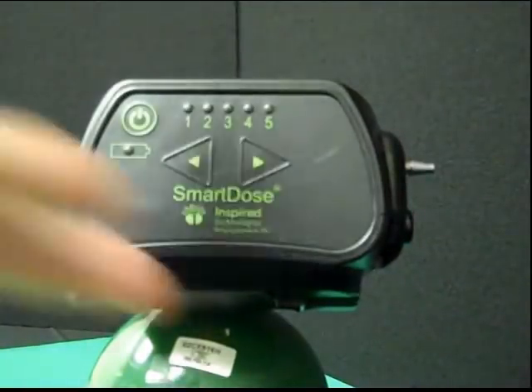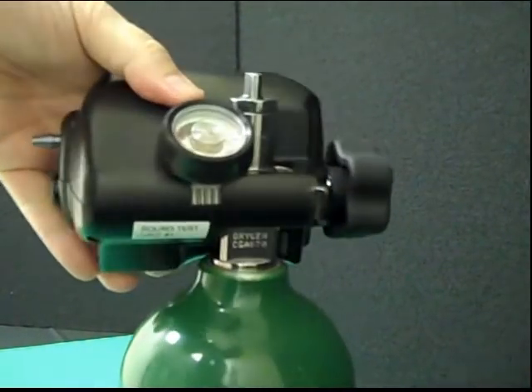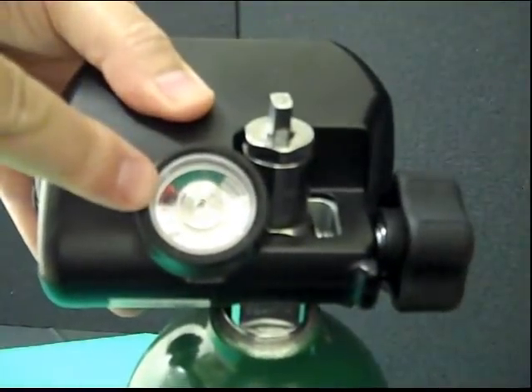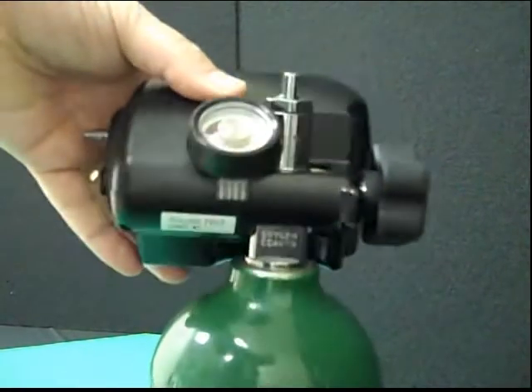To see how much oxygen is in the cylinder, simply turn the unit to the rear and view the contents gauge. It's a simple green-red gauge. Do not operate the unit into the red zone, as the pressure is too low and proper dosing will not occur.